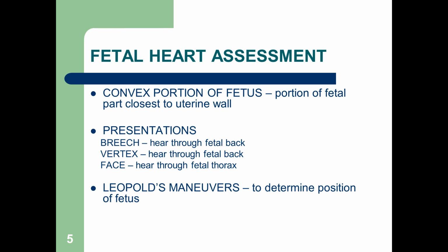If the presentation is vertex, you can hear through the fetal back. If it's a face presentation, it's through the thorax, okay? You use Leopold's maneuvers to help determine the position of the fetus. And again, you'll see nurses just place their hands on either side of the abdomen, and that helps them determine where to place the Doppler, so you can get the best placement for your Doppler to hear the heart tones.